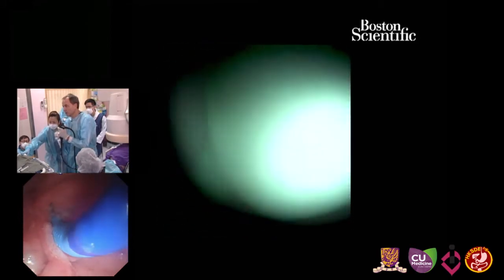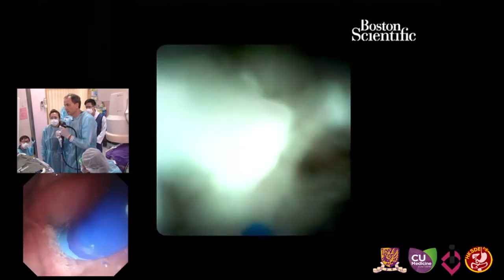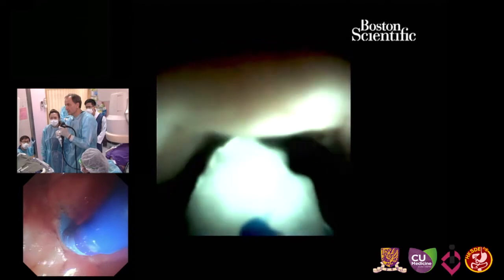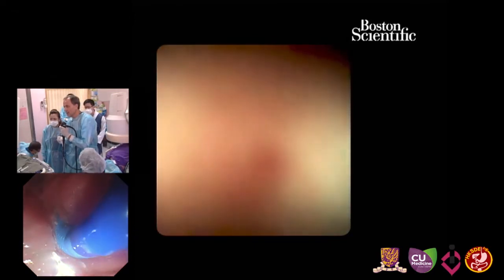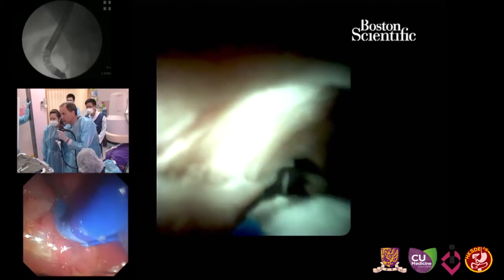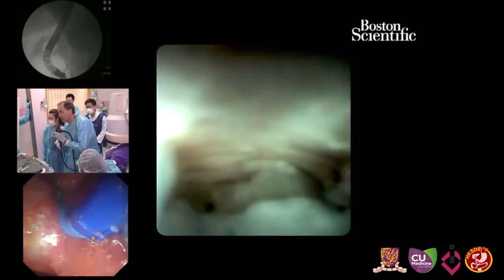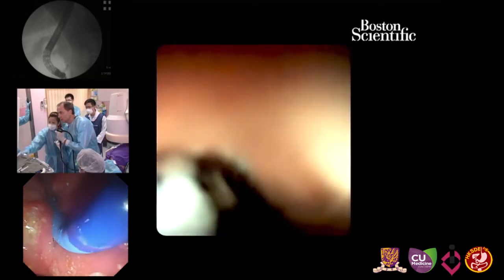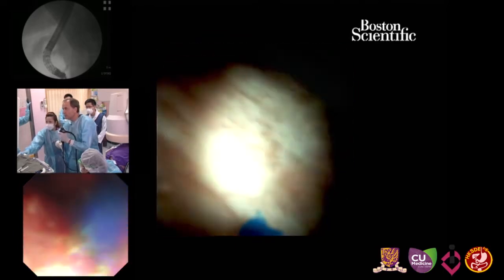Stop flushing. So I fire again. Is it a continuous water flow inside the spyglass? It seems to. Yeah, as we saw yesterday, this is the digital spy. With a 1.2 millimeter, 1.3 millimeter working channel, you can really appreciate it. Now flush again. So we flush, we are close to the papilla. So I think the duct is completely free now here.